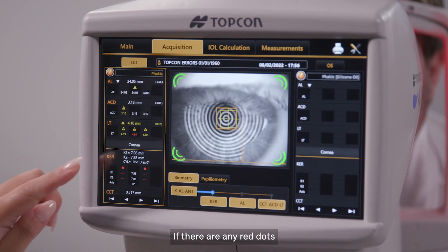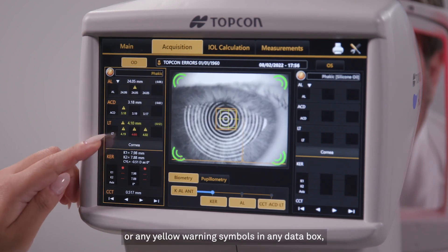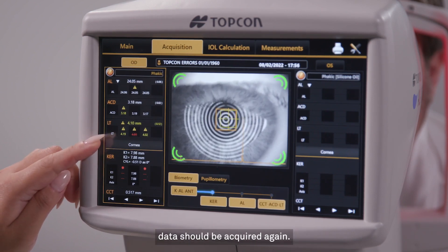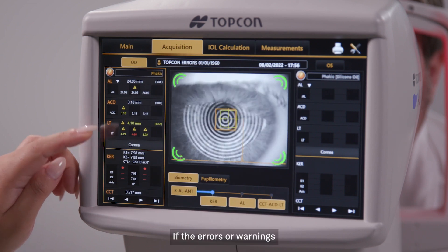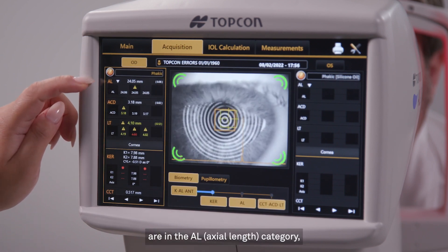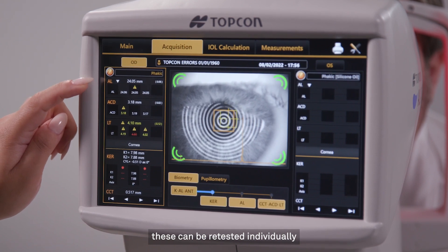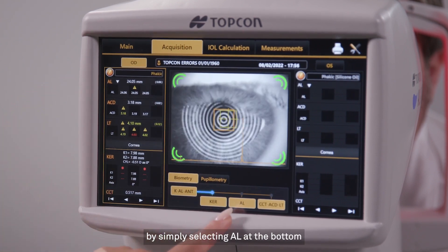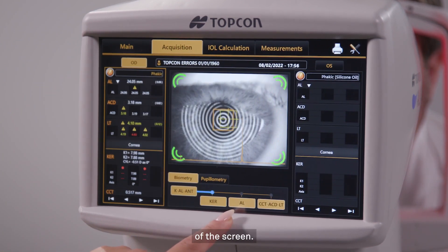If there are any red dots or any yellow warning symbols in any data box, data should be acquired again. If the errors or warnings are in the AL axial length category, these can be retested individually by simply selecting AL at the bottom of the screen.